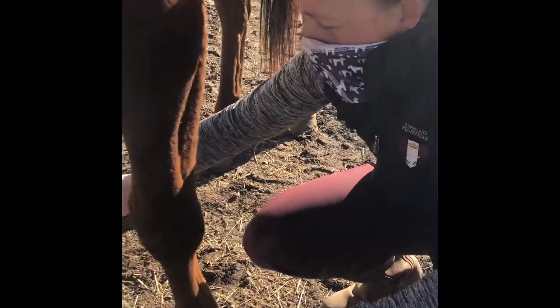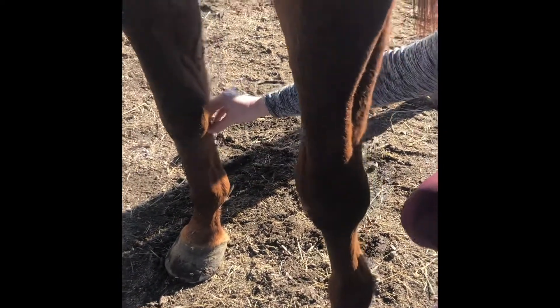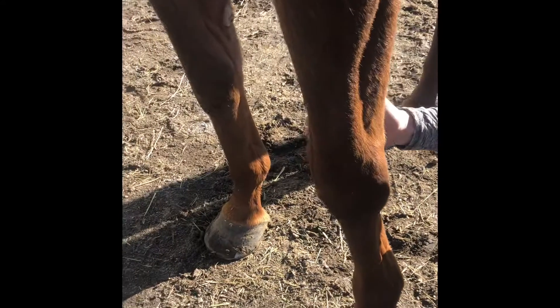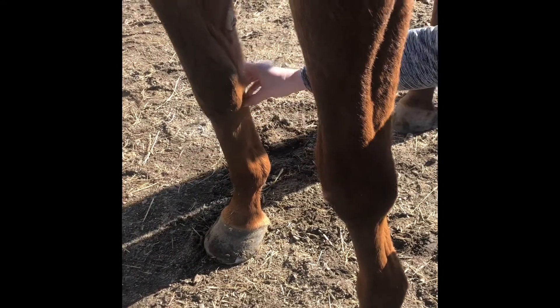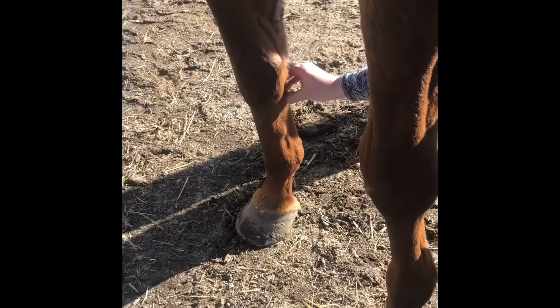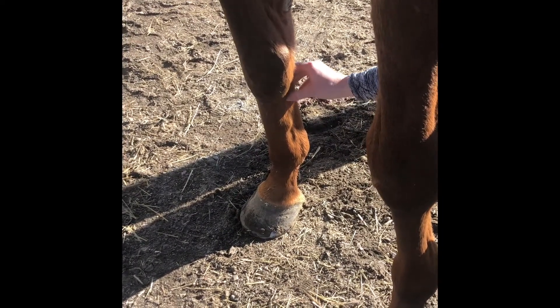To anesthetize the region where the splint injury is we need to do something called a high four-point block. We're going to be blocking two nerves — one between the deep digital flexor and the suspensory, and one just behind the splint bone.